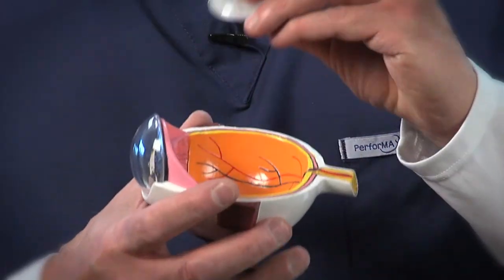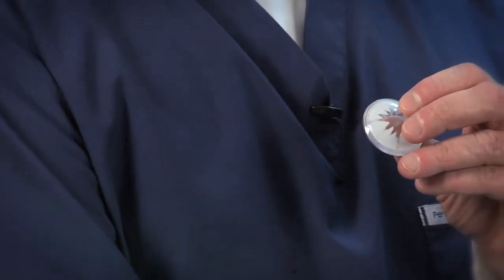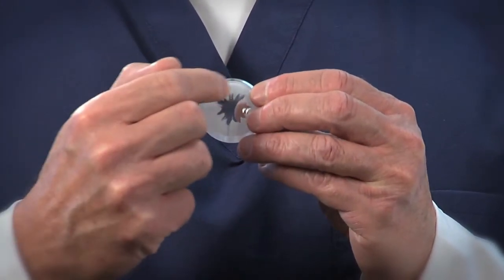One of the greatest inventions for cataract surgery that we have now is the laser called a LensX laser. I use the LensX laser in three parts of the cataract operation. We take the cataract, which is the lens of our eye turning cloudy, and we make a circular opening on the front of the lens.